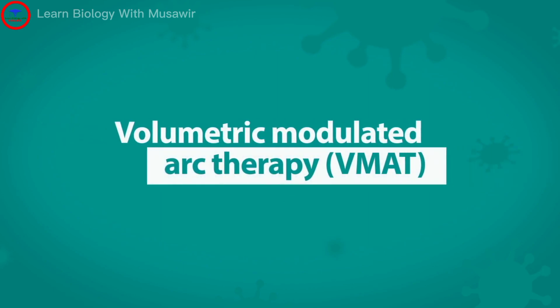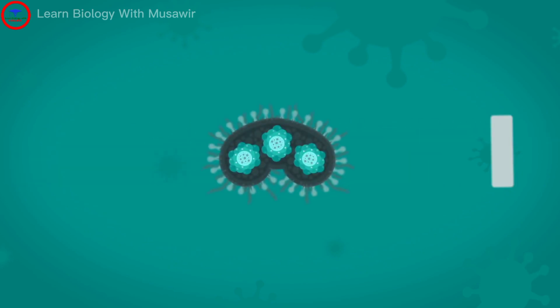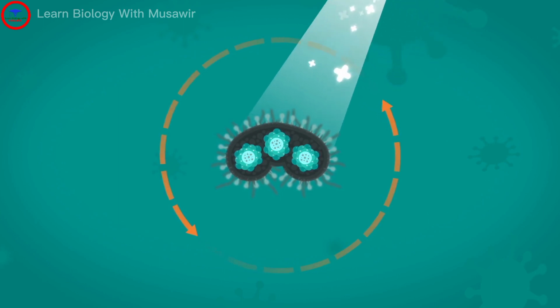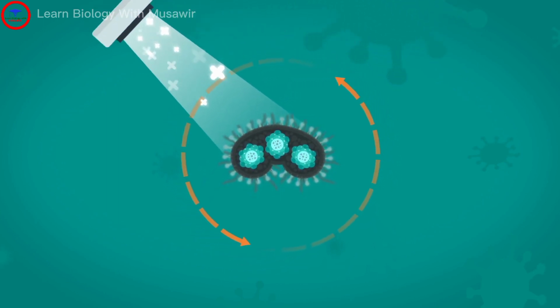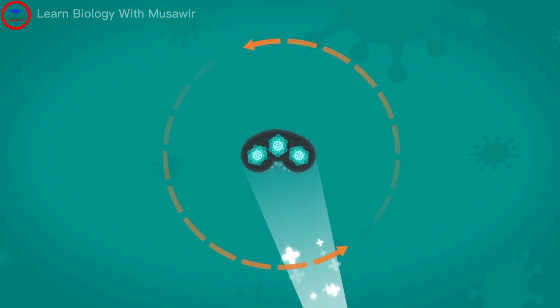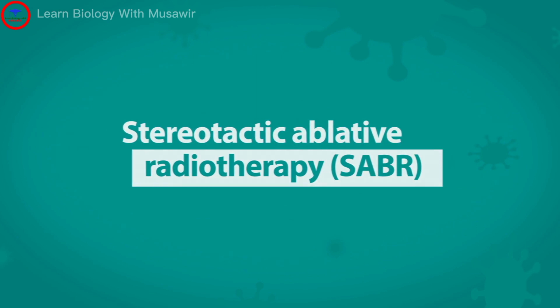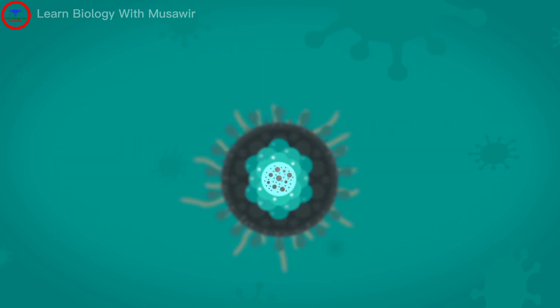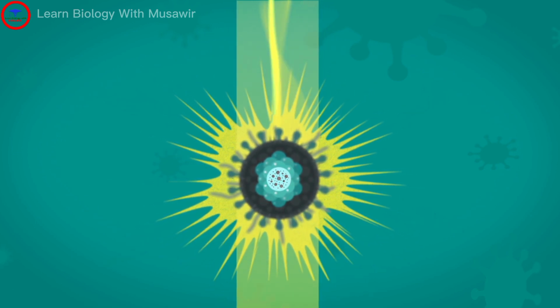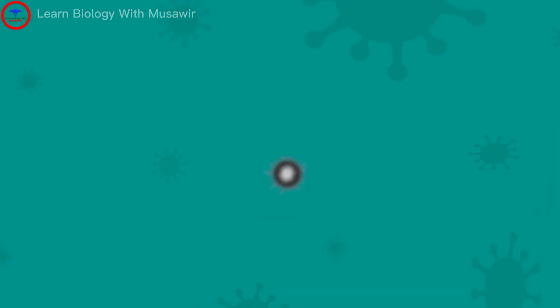Volumetric modulated arc therapy is a new type of intensity-modulated radiotherapy. It works by delivering a continuous beam of radiotherapy while the machine is moving, changing the beam shape and treatment dose automatically as it moves. Stereotactic ablative radiotherapy delivers a focused and very high dose of radiotherapy to a tumor in fewer sessions, offering some patients longer disease and symptom control. It is also sometimes used where surgery isn't an option.